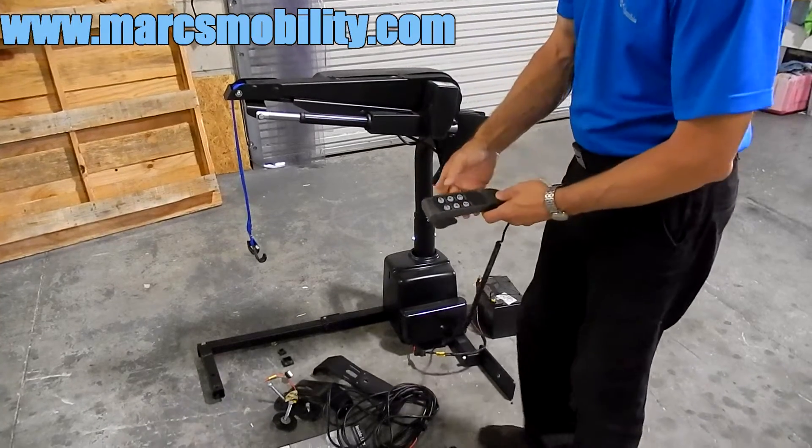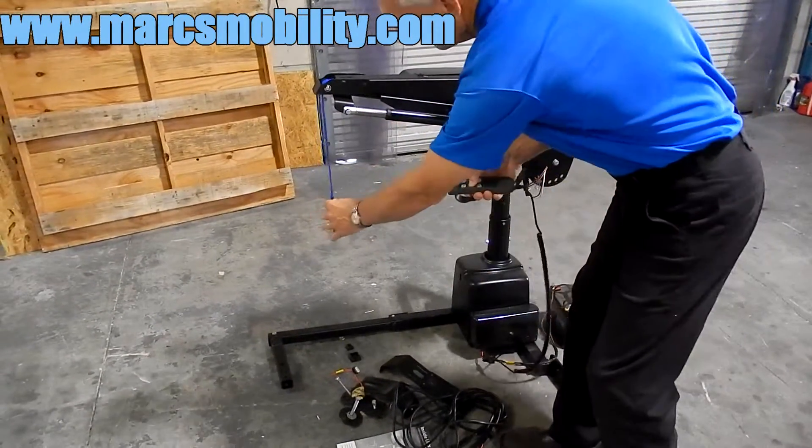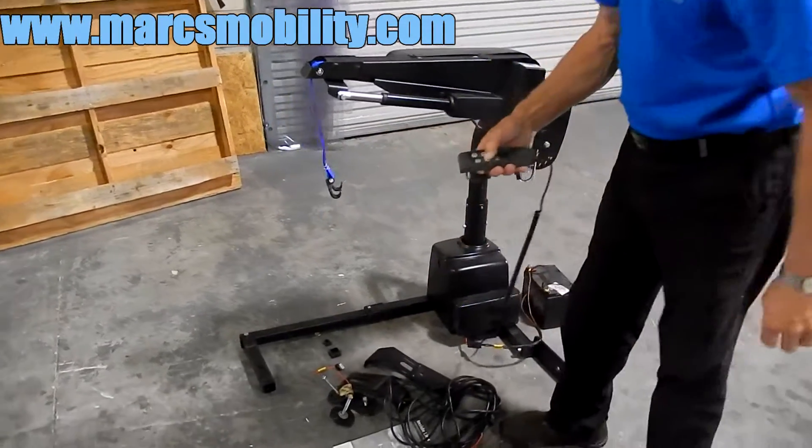The first thing I'm going to show you is how the strap goes up and down. You can see the strap goes up and down — this would be to pick up your chair.